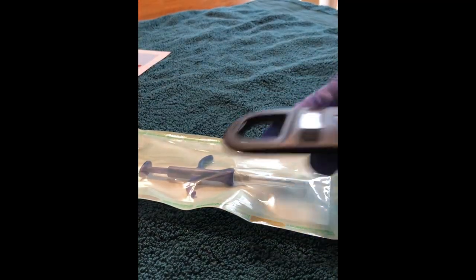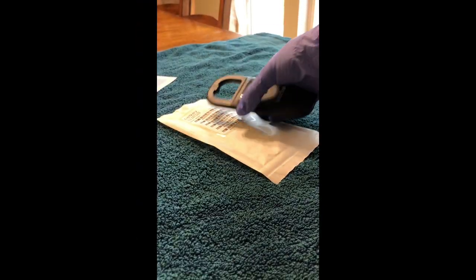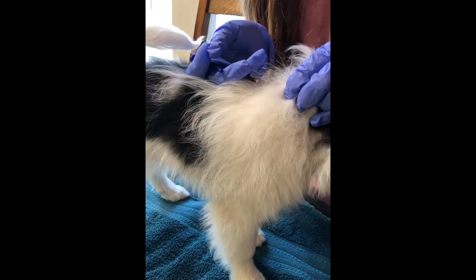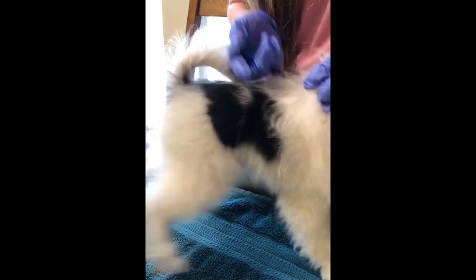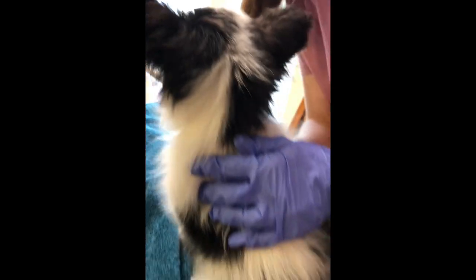Go ahead and scan the chip right now — it's reading okay, and it is the same number from the back of our microchip. And we're done! Made a little squeak, but there's no blood. You're all done, good boy!